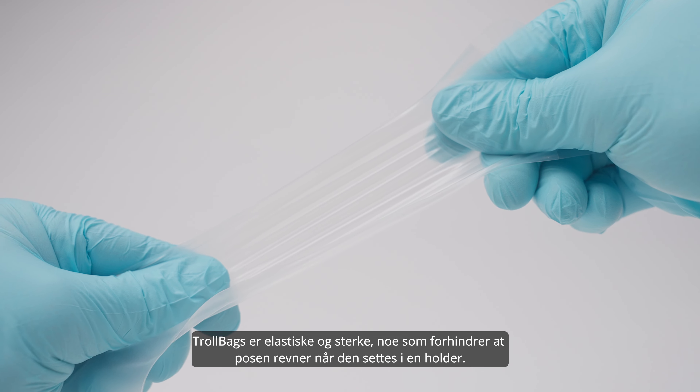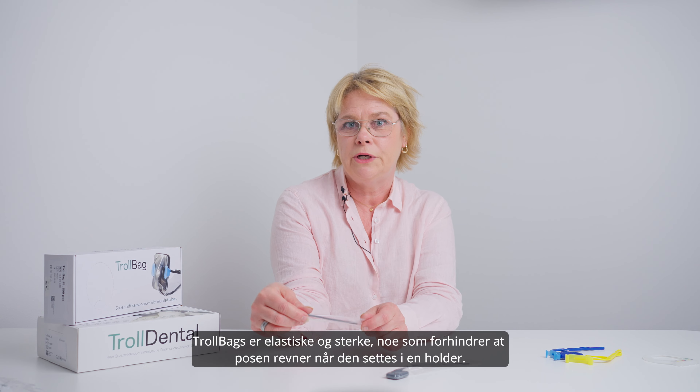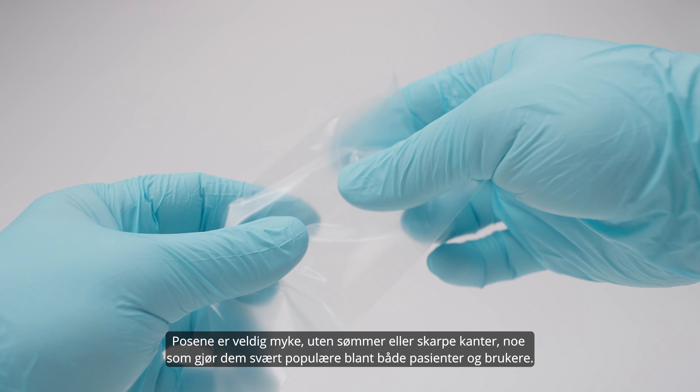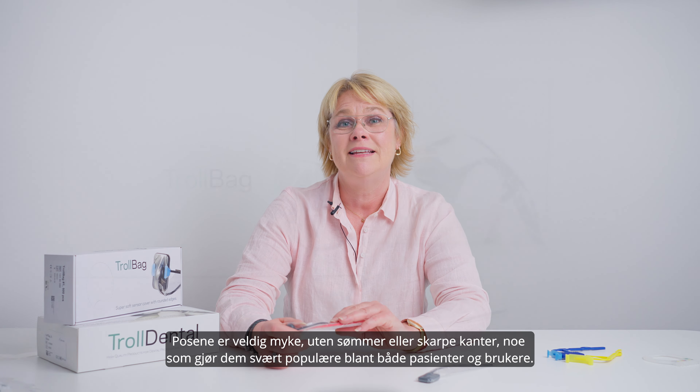Troll bags are stretchable and strong, preventing the bag from tearing apart when you put them into a holder. The bags are very soft with no seams or sharp edges, which of course also makes them very popular among the patients and the users.